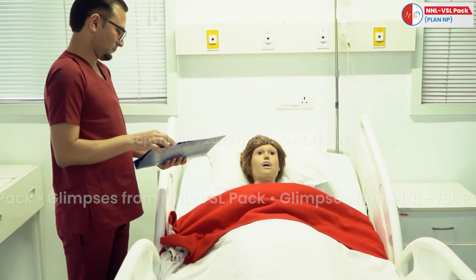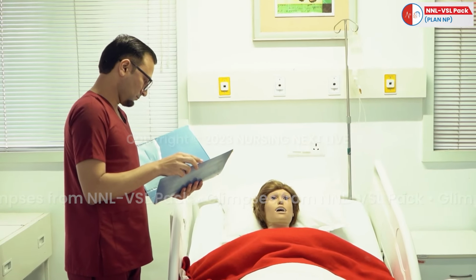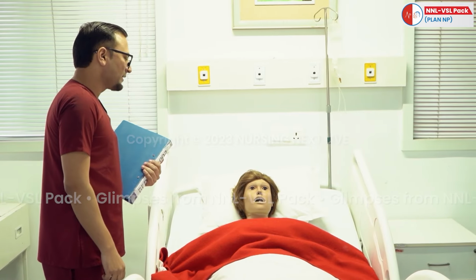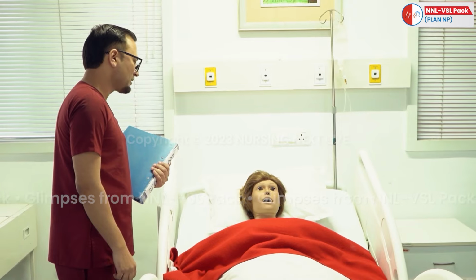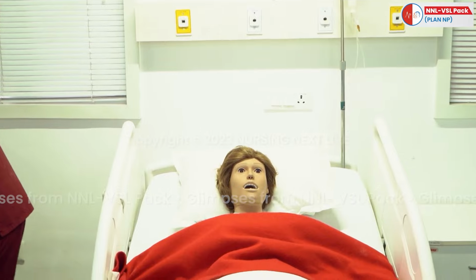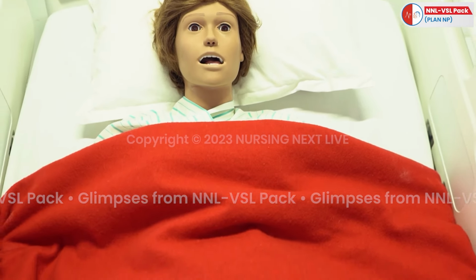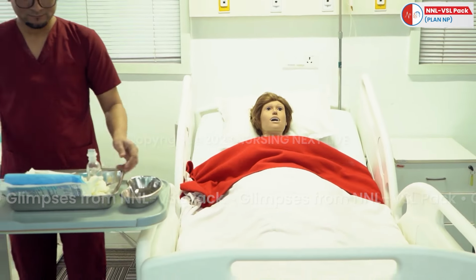Check the non-drug order sheet and CAUTI bundle checklist. Explain the procedure to the patient. Sir, as you have a catheter, the doctor has advised to give catheter care. So I am going to arrange the articles and come back within a few minutes. Arrange the articles. Provide privacy to the patient.